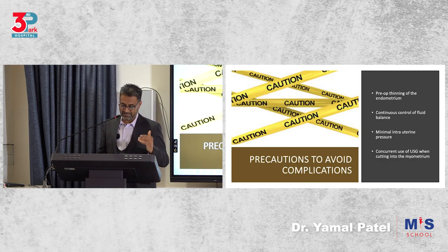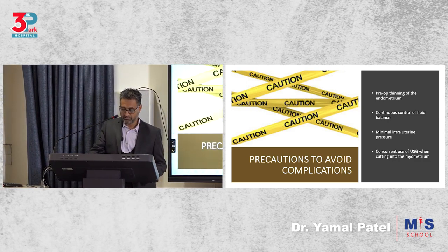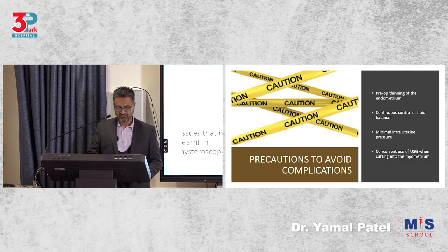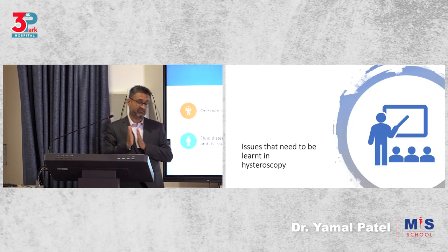Precautions to avoid complications. Try and thin up the endometrium before. Get a good continuous control of fluid balance. The pressure should be maintained to a minimum, etc. So what are the issues to be learned in hysteroscopy?